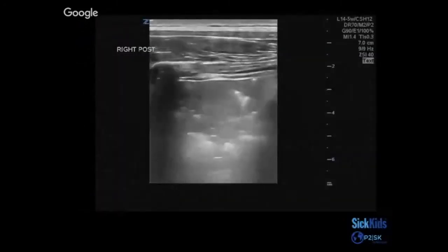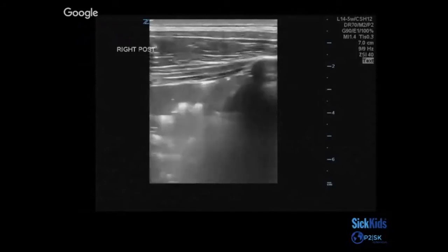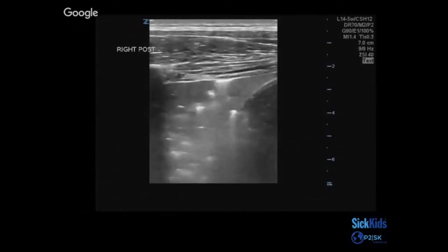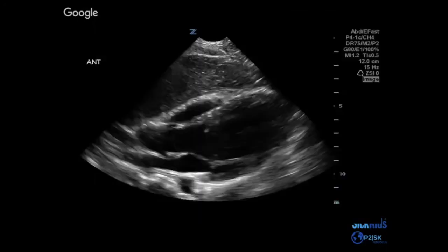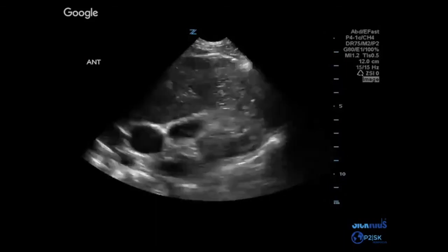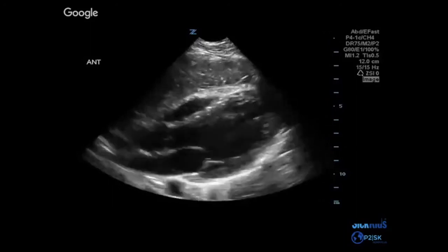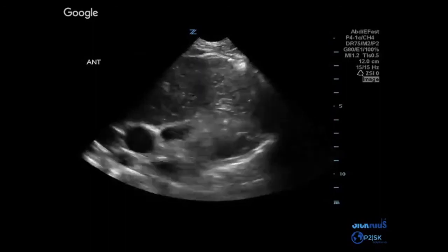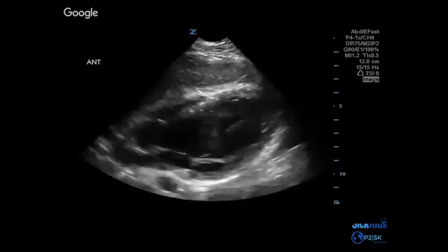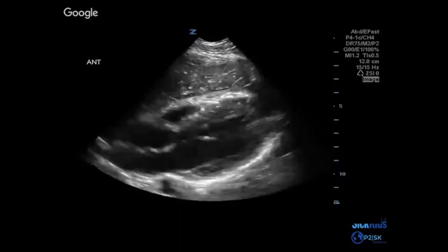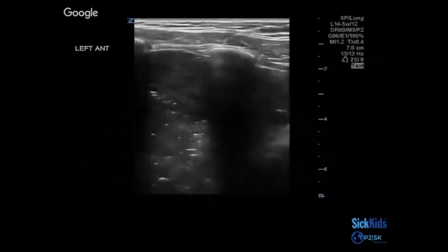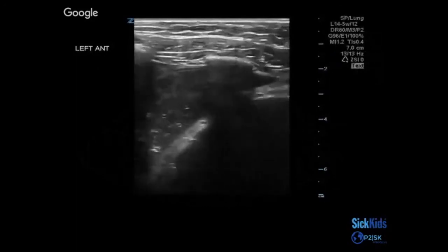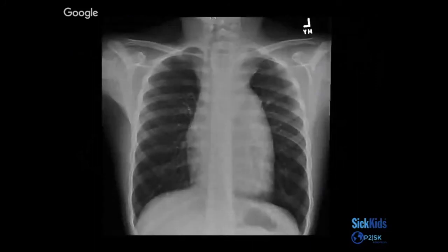Here's another application: a patient that came in post-drowning who had respiratory distress and was found to have pneumonitis on ultrasound. Here's another cool case of a 10-year-old boy who presented with distended neck veins for a few days but otherwise had no symptoms. When we scanned his heart, there was a lesion with a follicular pattern and hyperechoic areas within it just next to the heart. This is the phased array view, and then with a linear probe this is what we see. This patient actually had a mediastinal mass that ended up being a T-cell lymphoma.